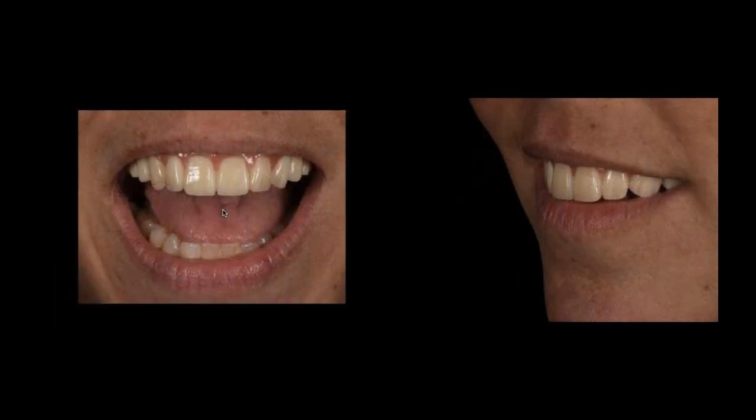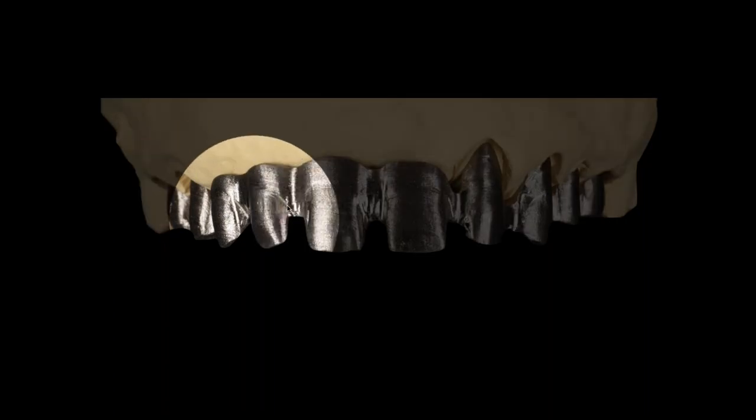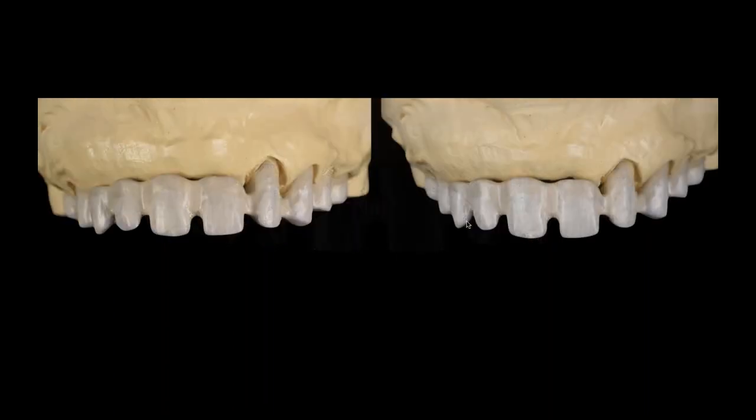So once we have the tooth position and the gingival position and all the things that we want, now it's time to actually get fabricated on the framework. The framework, again, was a metal framework, a large span. And the reason I went metal, not zirconia, was because I wanted the flexibility and I wanted to keep the embrasure spaces small and thin. So I had a lot of space to wrap ceramics and create more depth. With zirconia, I would have had to make much larger connectors. Plus, it would have been very rigid, which I didn't really want because of the four teeth that were there. I like to have some movement, and I'll get a little movement out of the framework.